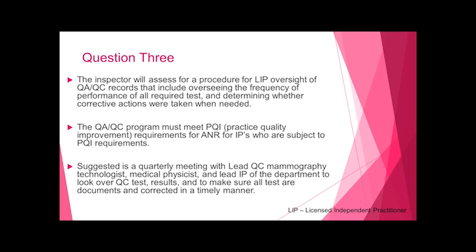Your quality control must be done in a timely manner, and when they state that you do it per manufacturer, that means not only is it done, but that it's done correctly, that the limits are set, and that your equipment passes. So they're asking, hey, you need to make sure and document that you have had meetings, that this is checked upon by the lead QC mammography tech, your physicist, and your lead interpreting physician.